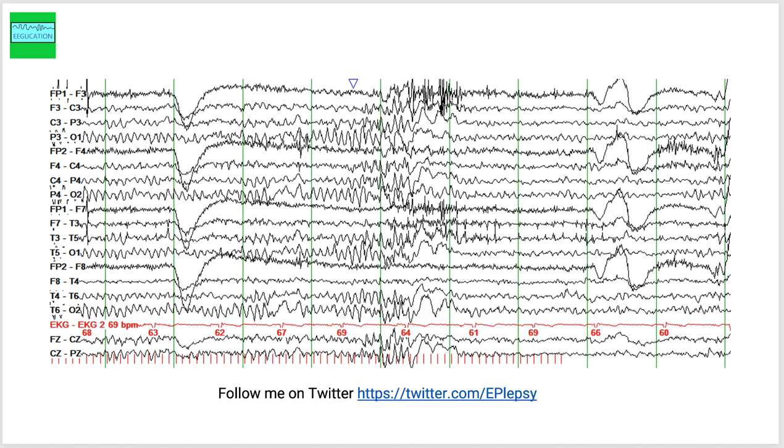And when you start the photic stimulation here, you have the photoparoxysmal response. If somebody presents to your clinic with seizures, I mean that is one question you want to ask.